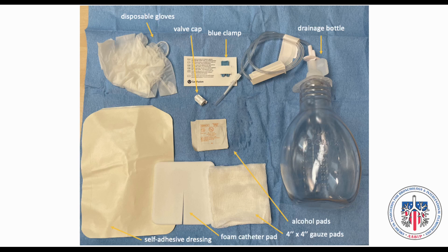Disposable gloves, valve cap, blue clamp, drainage bottle, alcohol pads, self-adhesive dressing, foam catheter pad, and 4x4 gauze pads are found in the pleural drainage kit.